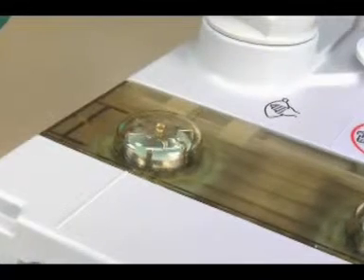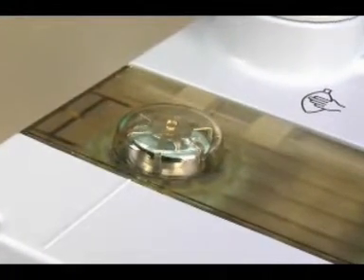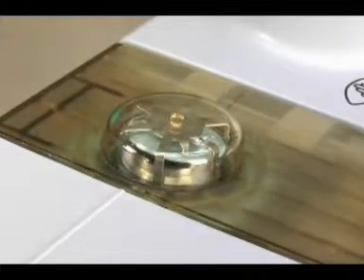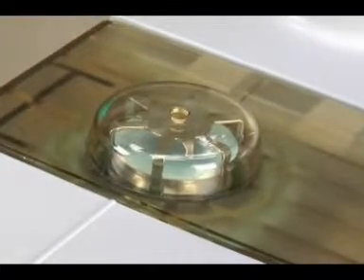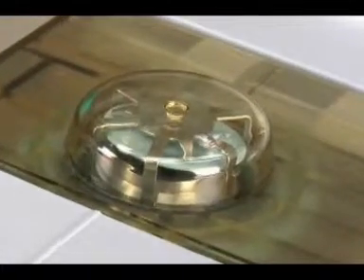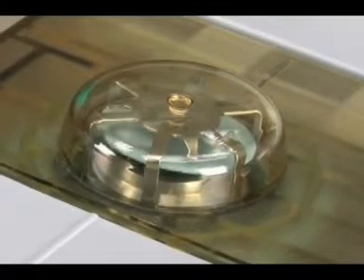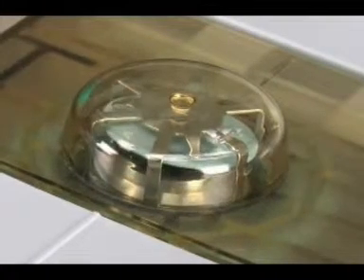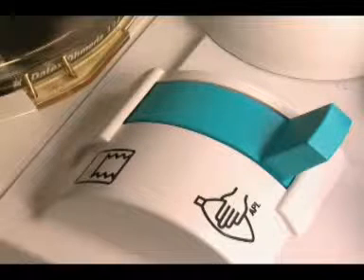There are 2 clear domes that are visible with thin, light discs that will flutter when the gas is passing through it. The discs are important to watch because they can malfunction, causing hypercapnia from rebreathing. The control panel has the bag ventilator switch. This allows the anesthesia provider to choose between manual, spontaneous breathing or machine ventilation by flipping the switch.